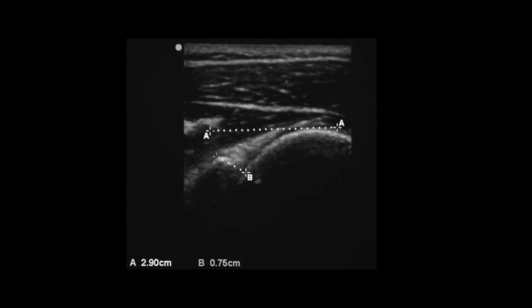Click Select, lock in the endpoint, and then get the line as close to parallel as possible. The y-axis of the cursor is used in this example. Once the caliper is well positioned, select the calipers button again. Obtain the tangent line off the glenoid, find the high point of the glenoid, and then work over to get a nice parallel line. That is locked in.